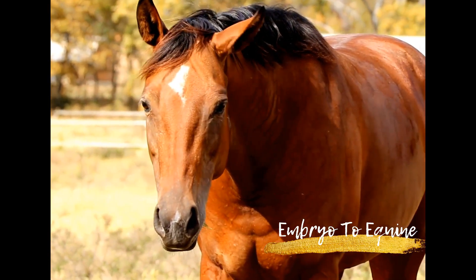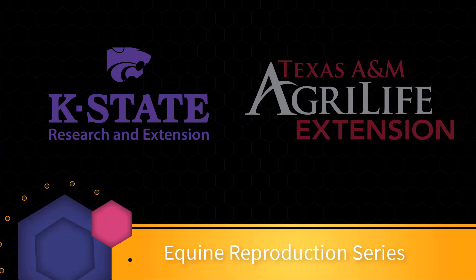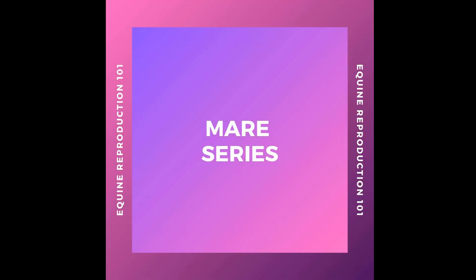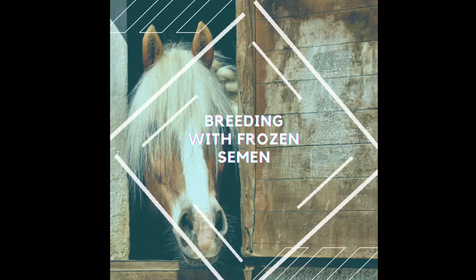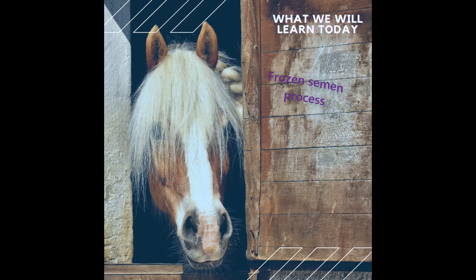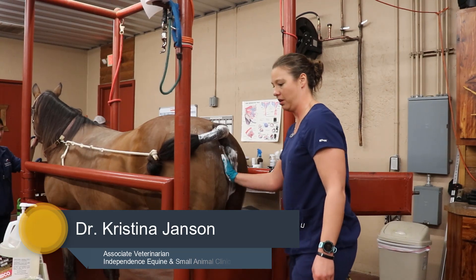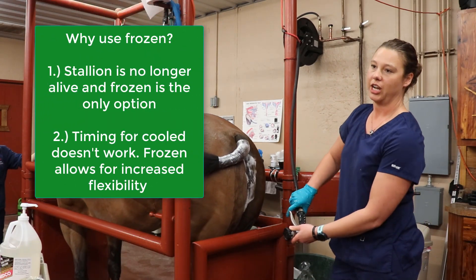Thank you for joining us. This mare we're getting prepped for frozen semen breeding. She had a 35mm follicle yesterday when I checked her on the farm in the morning, and I did her deslorelin injection around 5:30pm last night.